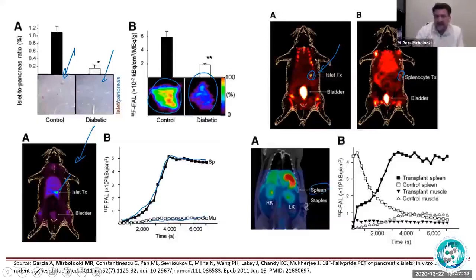Then I found a contrast for the spleen, like a CT scan contrast for the spleen. I injected the rat with that, so we can actually see the spleen. I don't need to manipulate the anatomy of the spleen to make sure that the area I am looking at is the right area. So I transplanted the islets into the spleen, injected the CT contrast, and injected falipride.